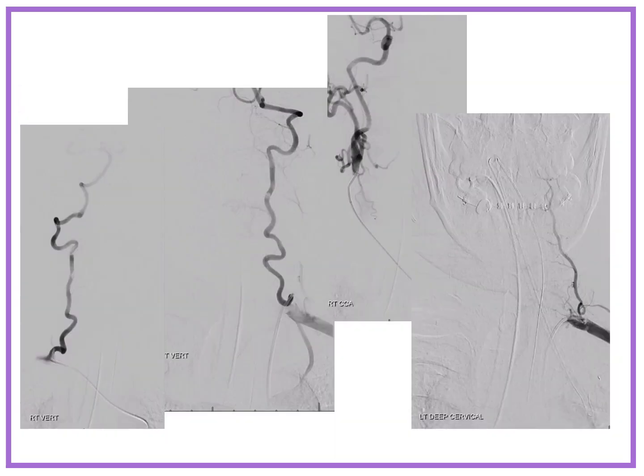So on we go, we do this whole brain thing. We do the vertebral arteries, the deep cervical on both sides, right CCA, left CCA. Just show a few of them. We need to define the entire axis. Why? Well, sometimes there's a big anterior spinal that's coming all the way down, exceptionally rare, but we've seen one or two.